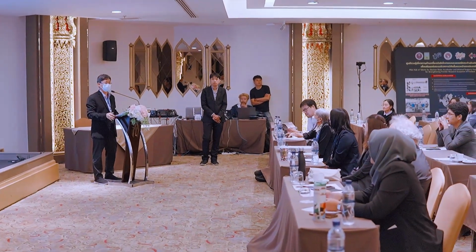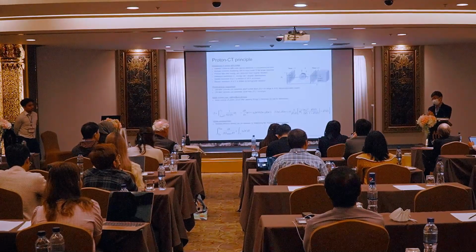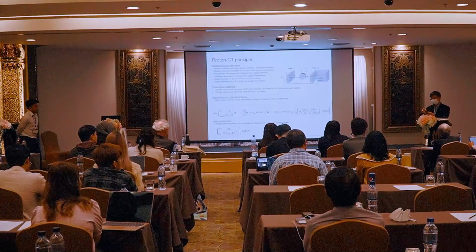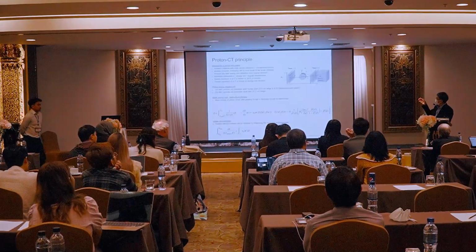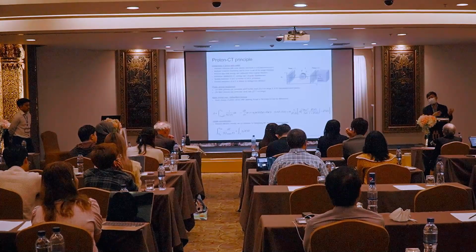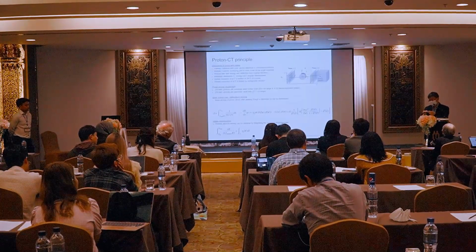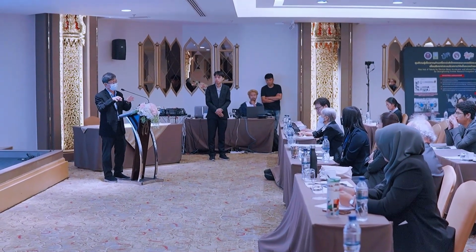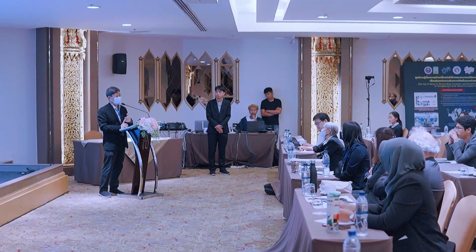So actually, what we try to do first now, we have another team called the radiobiology team, led by Dr., who is a postdoc of mine, and another postgraduate researcher, Prawa. We are doing an in vitro experiment. We want to culture a cancer cell line and put it on a well plate, to see whether our proton can distinguish between cancer cell and normal cell, using the standard phantom. That's our plan because the well plate is not so thick. It is the phantom for the biological sample. So that's the first way that we want to do it.